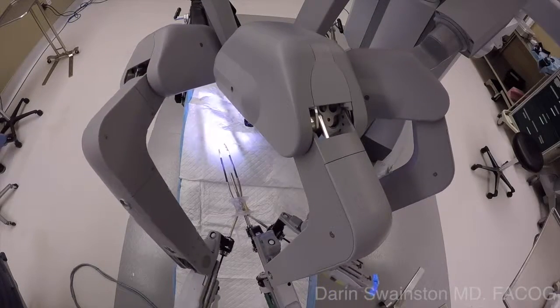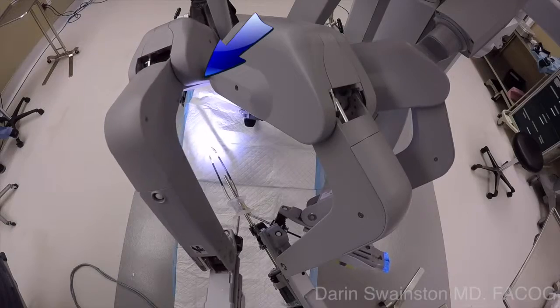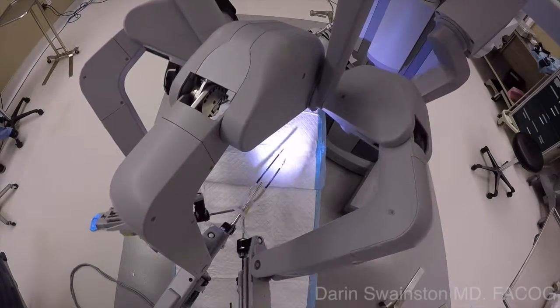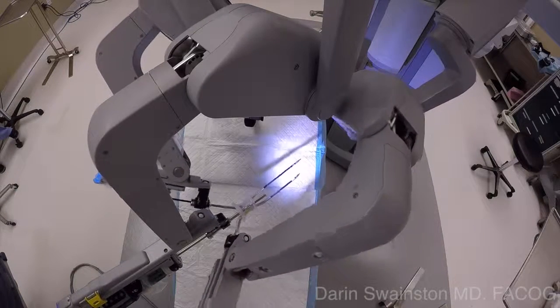Here's a depiction of when that collision occurs — you'll see it right there, hitting up high. That limits the range of motion on the left side with the side dock. It's not quite as effective as a center dock; however, the motion is adequate to do most hysterectomies.